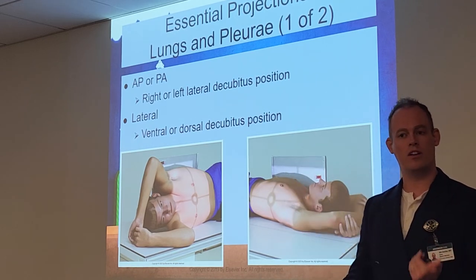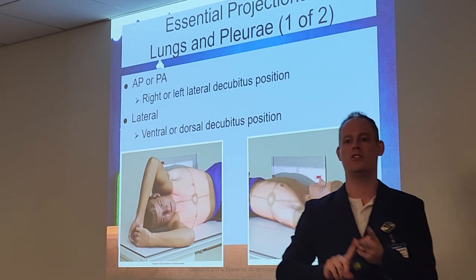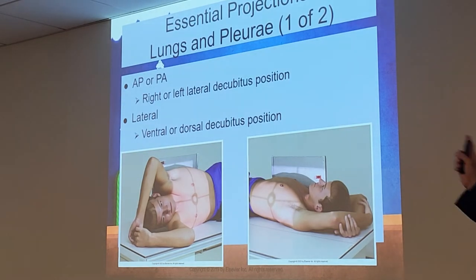So make sure you write down, when it comes to these decubes, am I looking for air or am I looking for fluid? That's going to determine which decube I do. You typically have the option of AP versus PA. That really does not matter. It's just basically for the patient's comfort.